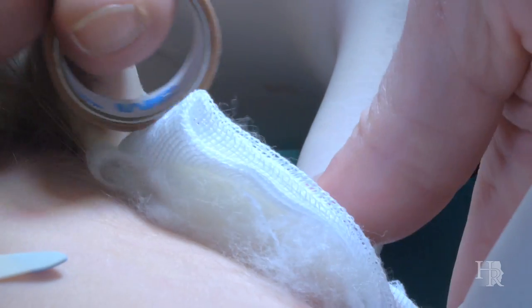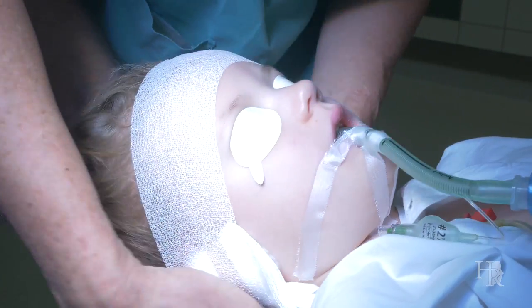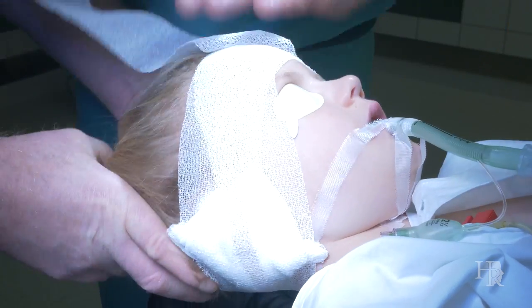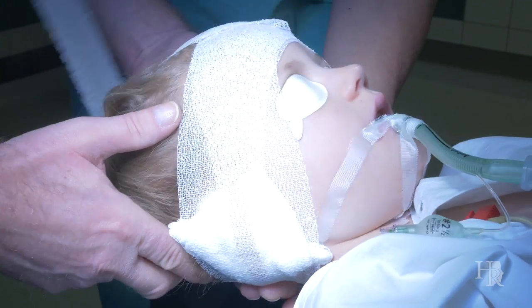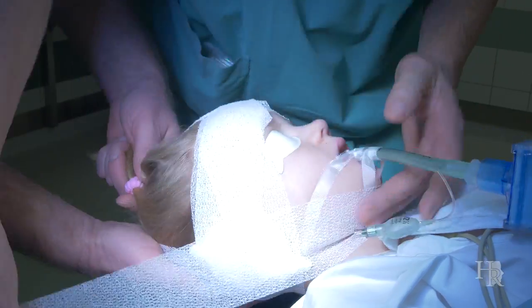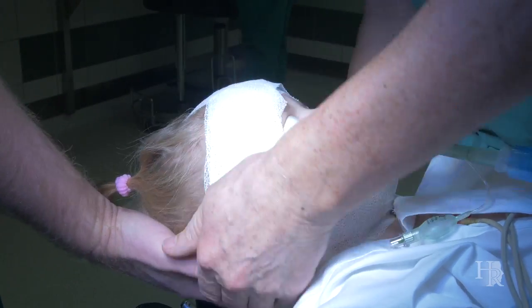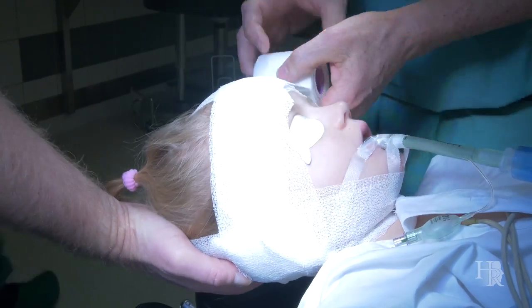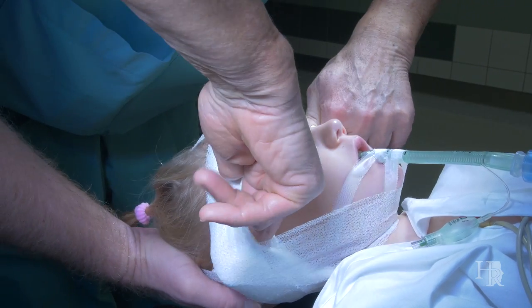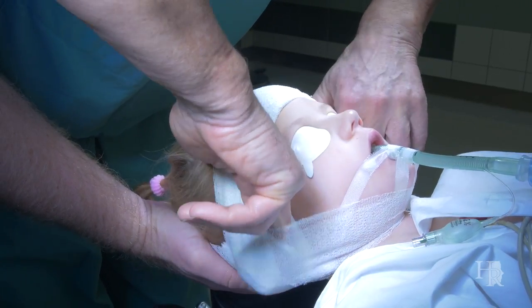Now you can see how the head bandage is done. Especially for children it is always necessary to avoid slipping of the bandage, neither downward nor upward. You make a control check the next morning to confirm everything is fine. It is also very important that you make the head bandage very loose, so that no pressure is on the auricle — otherwise you can get skin necrosis, and the first symptom is pain. In case of any pain, take the bandage off and control the wound.